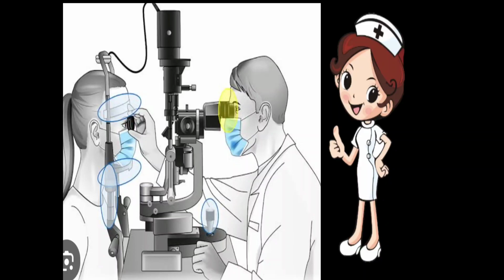In this, the height of the patient should be adjusted according to the examiner. Okay, so the chair should be able to go up and down according to the position of the patient so that the examiner can position the patient and examine the patient very carefully.